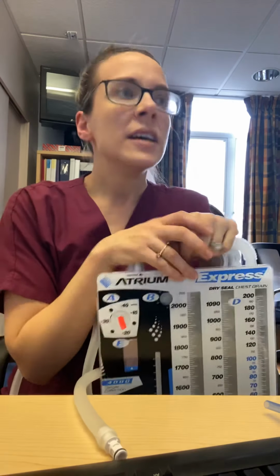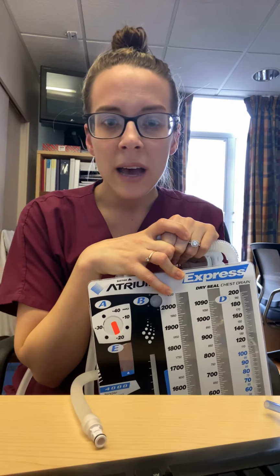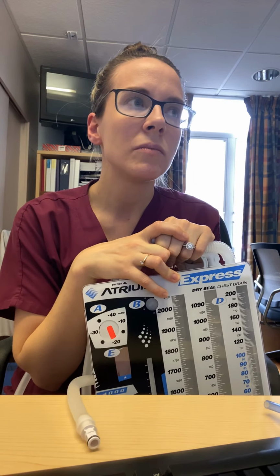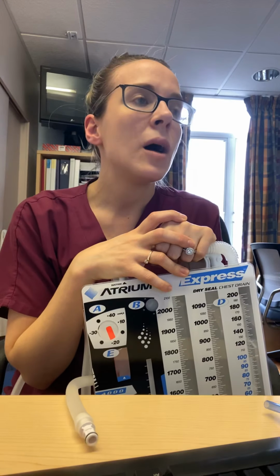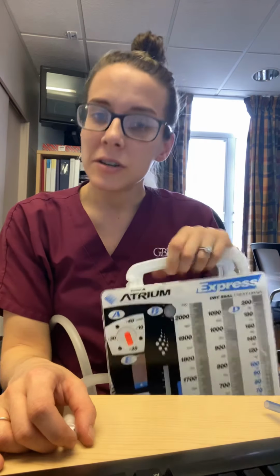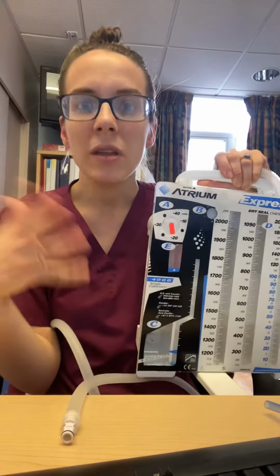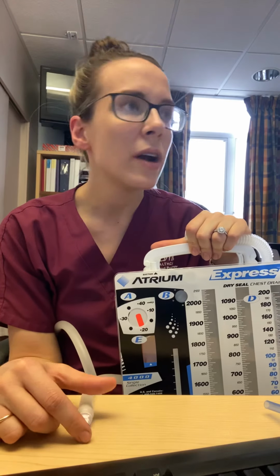Okay, and finally, removing chest tubes. I feel like Dr. Sullivan will do that by herself most commonly now, but if you need to or asked to, this is how you do it. Typically, you want to make sure that the output from the chest tube is less than 200 cc's in 24 hours, that there's no air leak in your air leak chamber with deep breathing and with coughing, and that on the most recent chest x-ray, there's no pneumothorax.